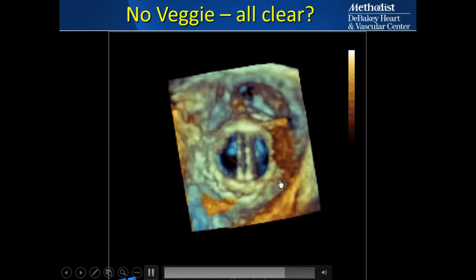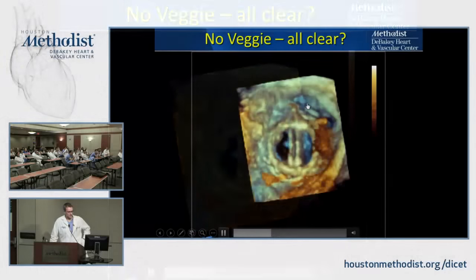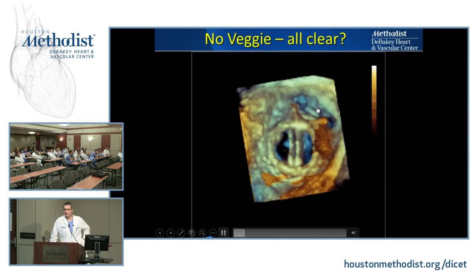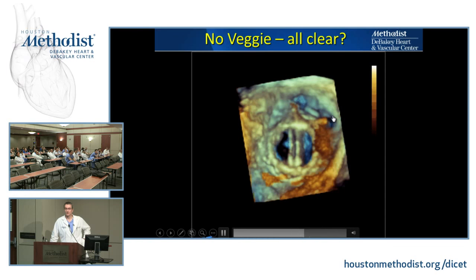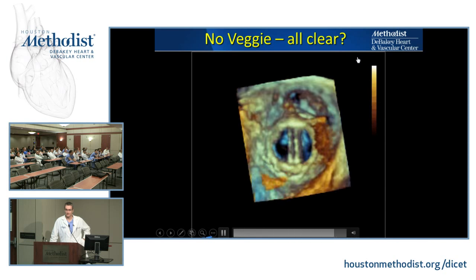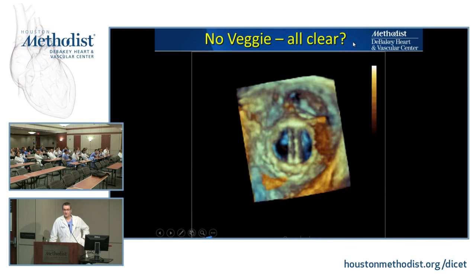Any concerns with this one? There's no obvious vegetation. 11 o'clock, right. This thing that some may have thought was the aortic valve or something unknown, this is a massive paravalvular defect. So this is basically the crux of the heart fell apart. He'd had his crux rebuilt basically with pericardium at the first surgery with clear instructions to never get infected. That was his discharge summary. And it didn't work. And he actually had to go to hospice because there was nothing left to rebuild.